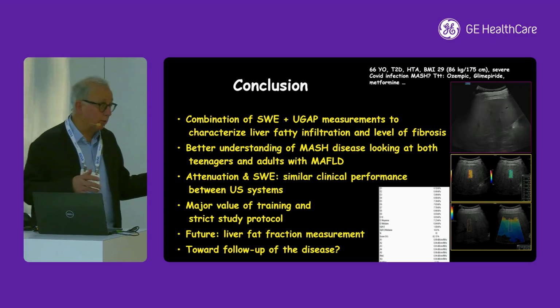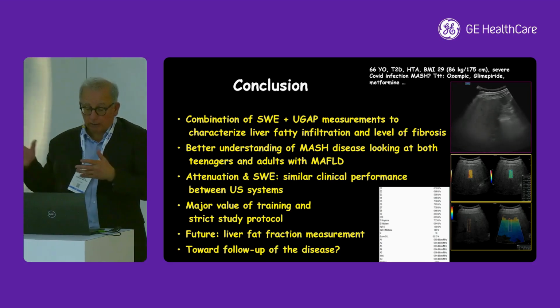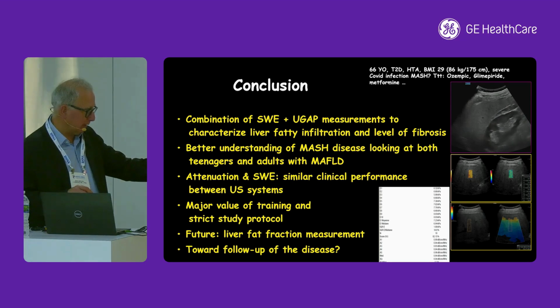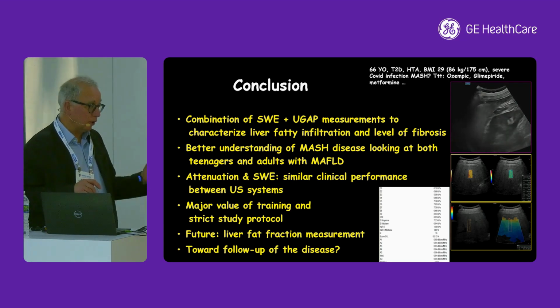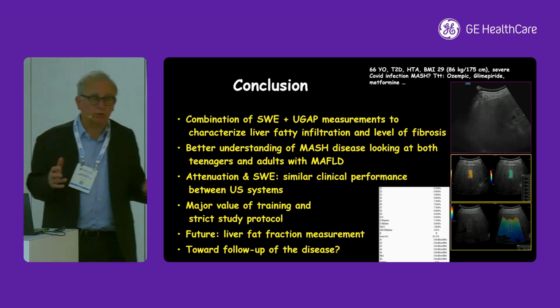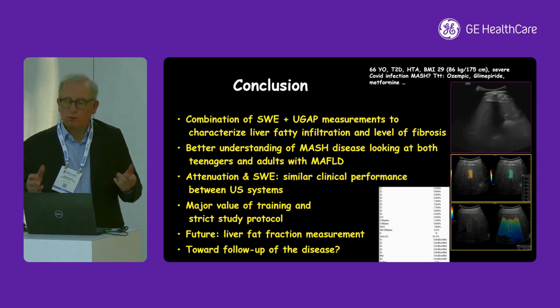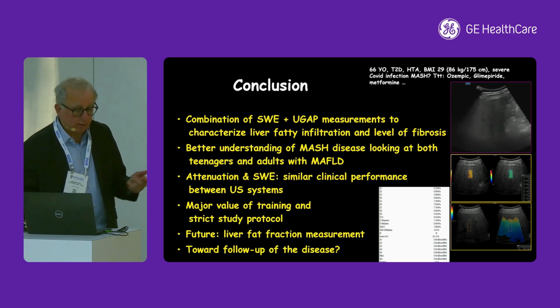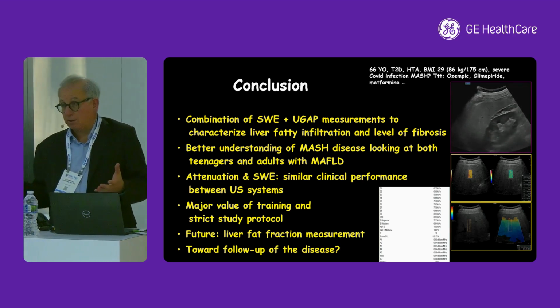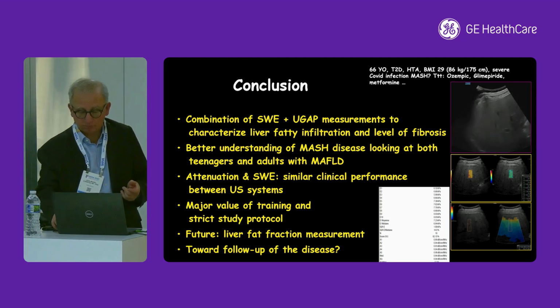There's a major value of training, again, and a very strict study protocol. And I would like to show you some of the tricks if we are on time, and we are on time. And for the future, of course, we would love to get liver fat fraction measurements, but I know that all companies are working on this. And the ultimate stage is, of course, to be able to follow up these patients. And I think that this is exactly what we would like to do.